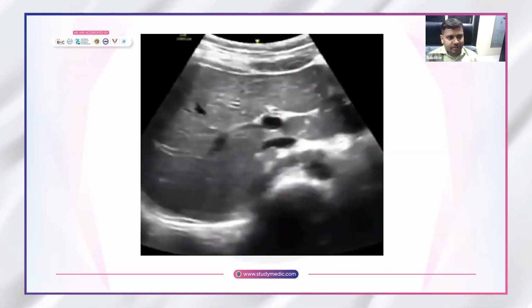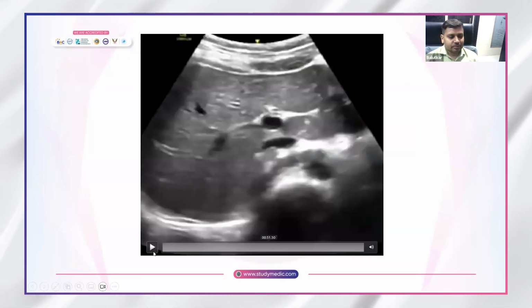So this is one video in which we will be discussing various structures which will be seen during the ultrasound examination of the liver. Just play the video for me, Noreen. Noreen, can you please play the video for me?